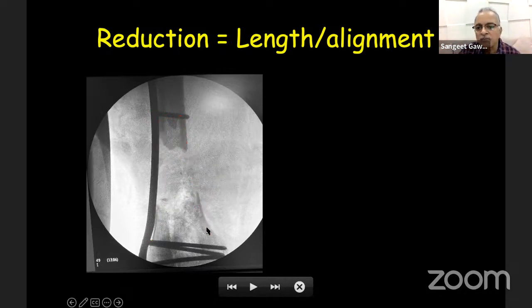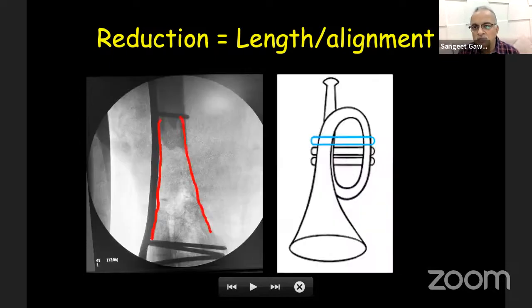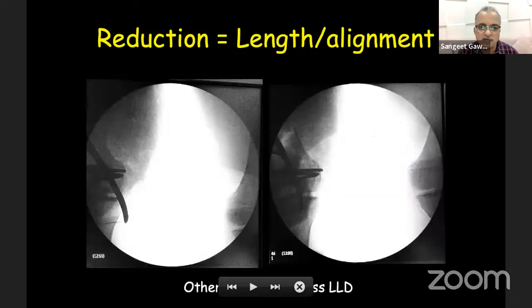Otherwise, you'll have a picture like this where you don't see a proper trumpet of the distal femur. That means there is something wrong. You have not reduced it well. So that effect you must try to see.